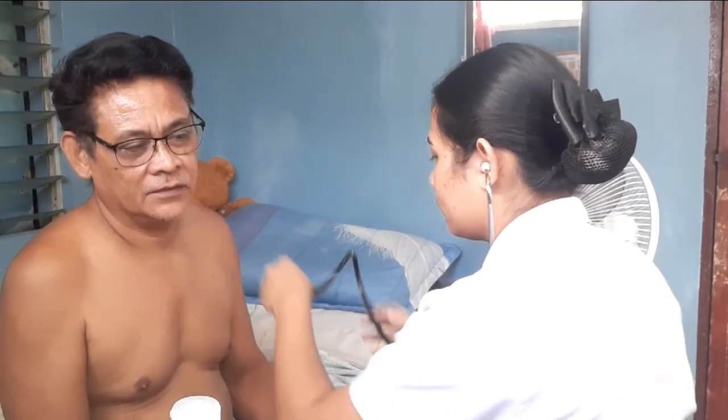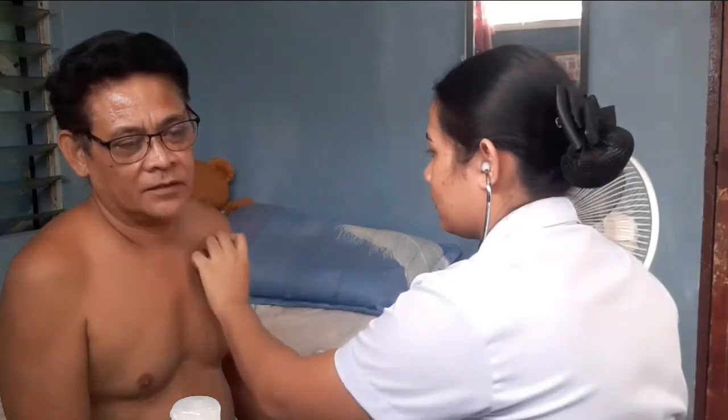Can you please whisper 99 for me? Okay. Okay, so I'm going to start to auscultate.